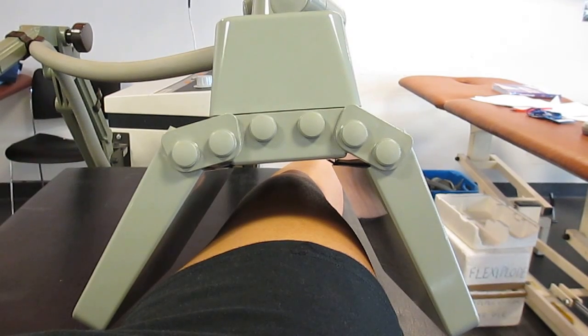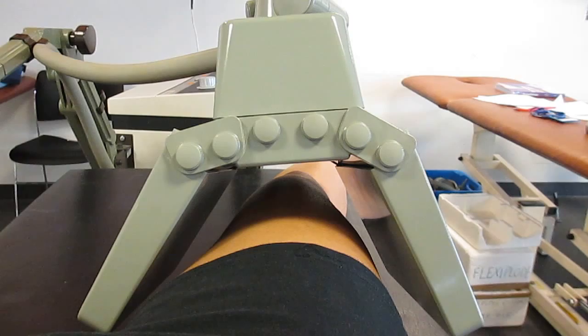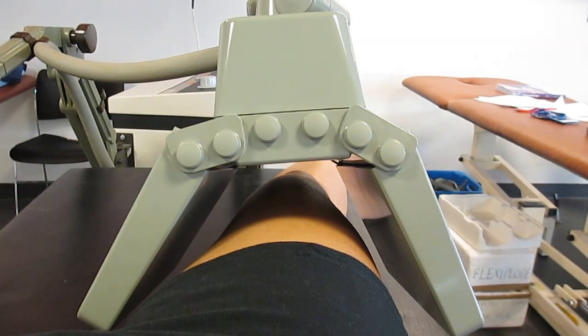This flexiplode can be used in the continuous setting for more chronic conditions, or in the pulsed setting for more acute conditions.